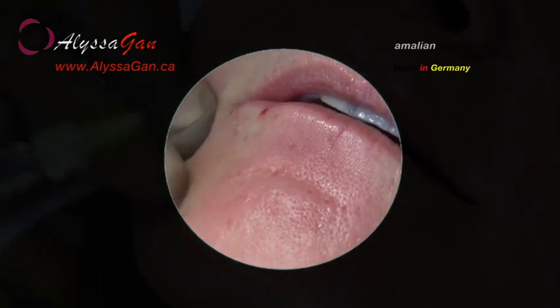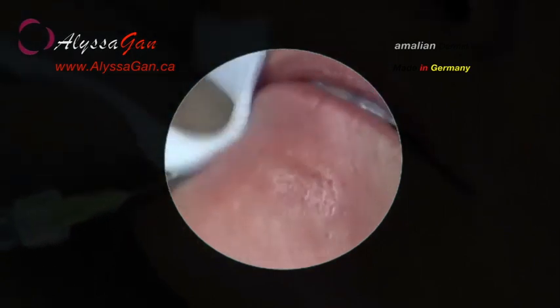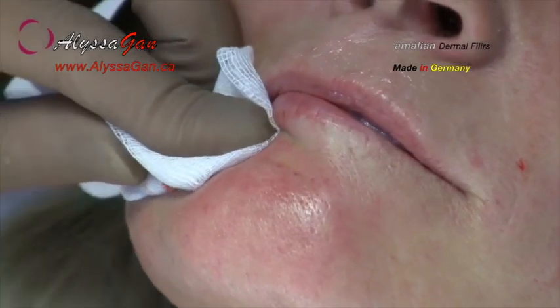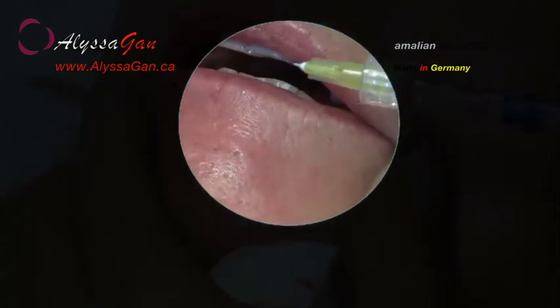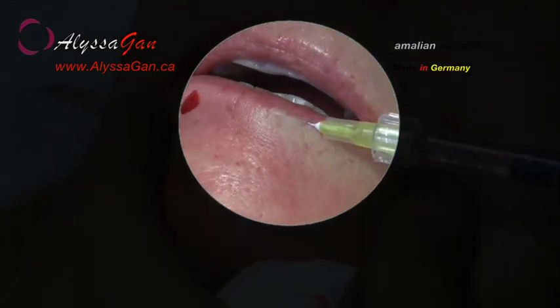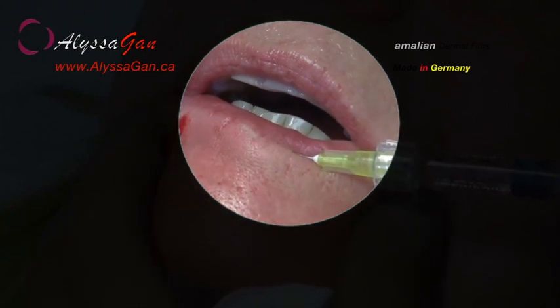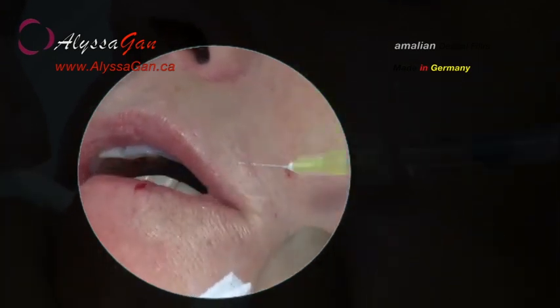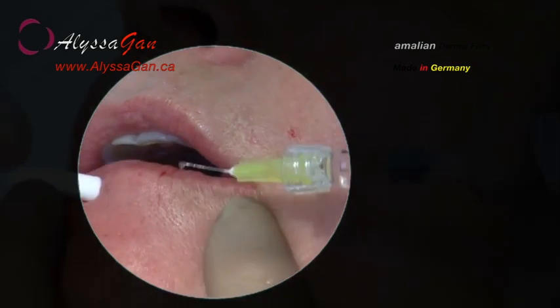For the small wrinkles running toward the vermilion border, the cannula is directed longitudinally to the wrinkles, and the injection is performed. Depending on the wrinkle size, the physician uses either the punctual or the linear injection technique. In treatments of the vermilion border, it is beneficial to stretch the skin to be able to prepare the injection tunnel precisely. Also on this side, the fine wrinkles running toward the vermilion border are treated with the punctual or linear technique, depending on their size.